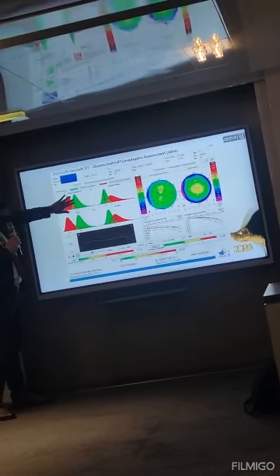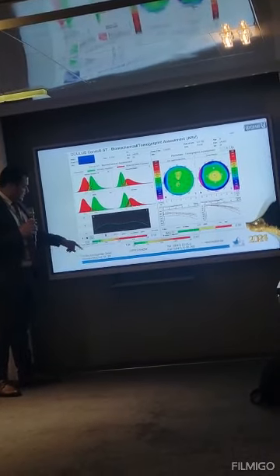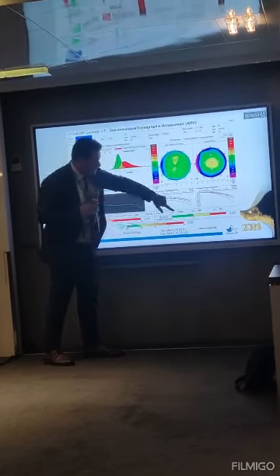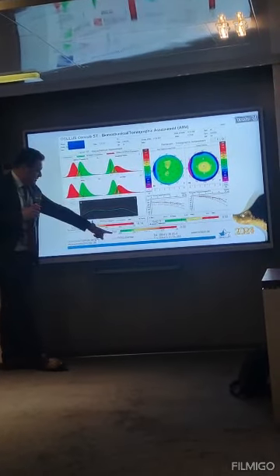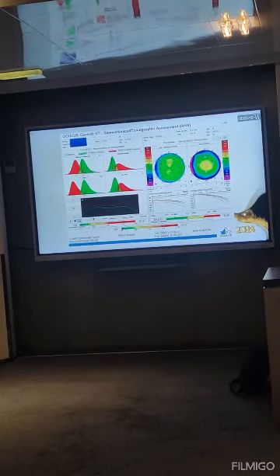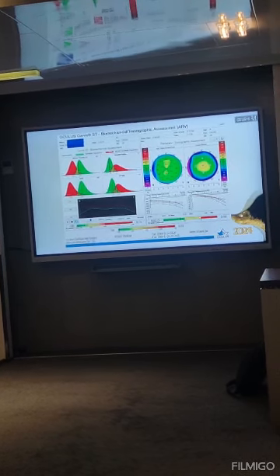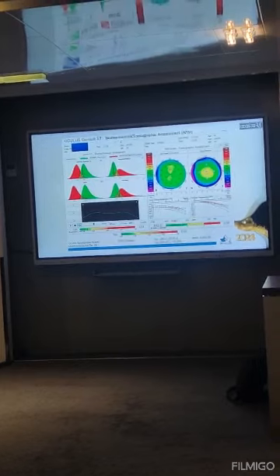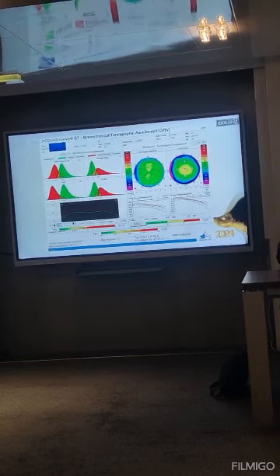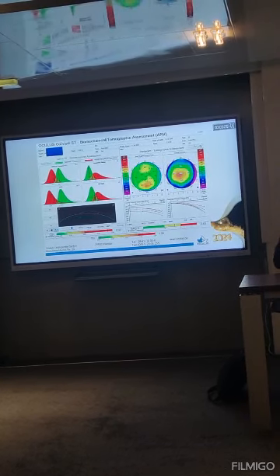So here you can see the stiffness parameters, the integrated radius, the DA ratio, the ARTh, and here is the CBI with its value, and here is the BAD-D from the Pentacam. This part is taken from the Pentacam, and this is the TBI, which combines both of them. Actually, it's not just a combination of both of them. They speak different languages, but still you can have a clue about the shape and the biomechanics in the form of the TBI down there. And still it's green, red, orange, so you can interpret it with the colors.